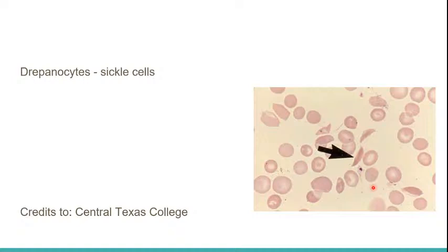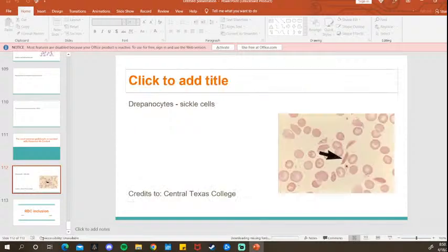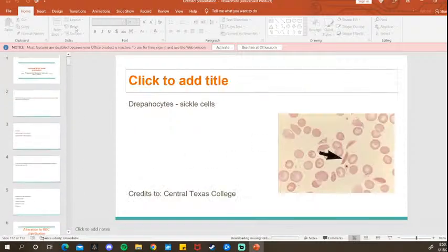All right. Now, final thoughts on RBC anomalies before we move on to inclusion bodies and abnormal WBC structures on our next discussion: we need to go back to the basics. You need to understand the very first slide that we talked about earlier.